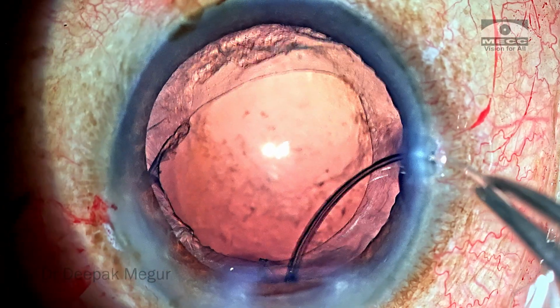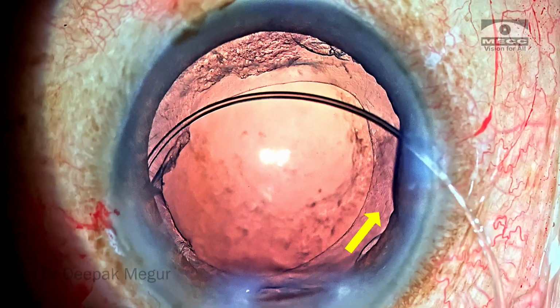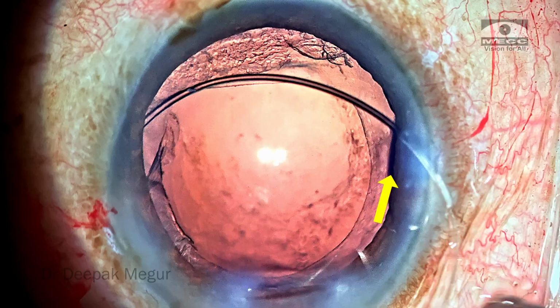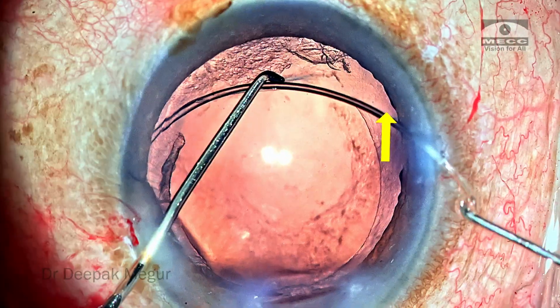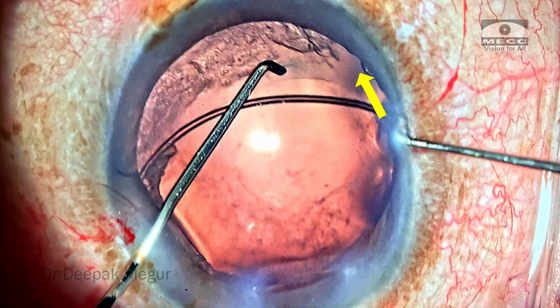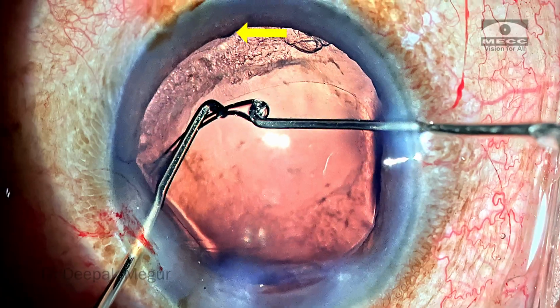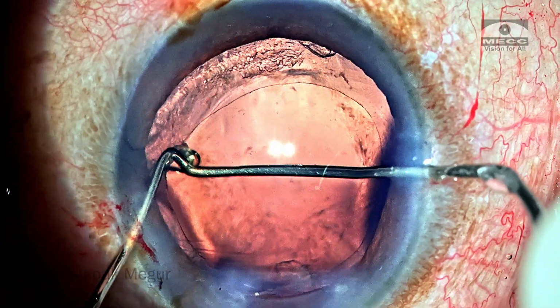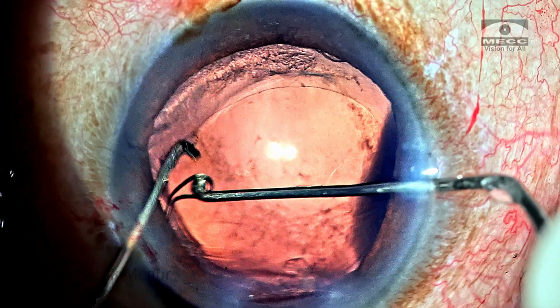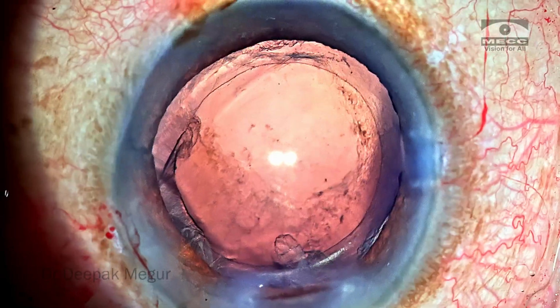It's mandatory that we push it in a tangential way rather than pushing it vertically down. So it's important to remember that the path the ring is going to take is tangential along the equator of the capsular bag. So we need to be mindful of the surgical anatomy here, and we cannot shove it posteriorly. That's going to put a stress on the posterior capsule, and there's always a risk of tear. Obviously, inflating the bag very well with the OVD does help.